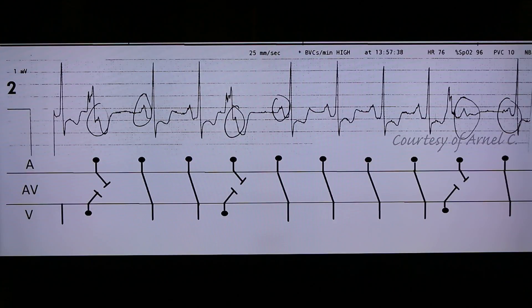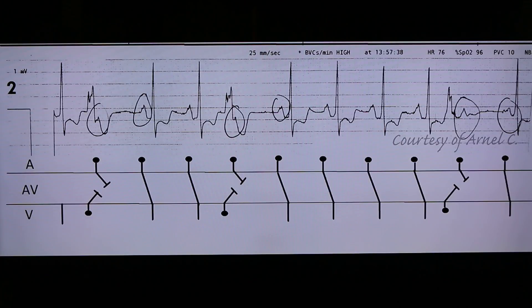This may mimic a 2nd degree AV block, but actually it is not. So the next time you see a blocked P wave after a PVC, think of concealed conduction and not 2nd degree AV block.